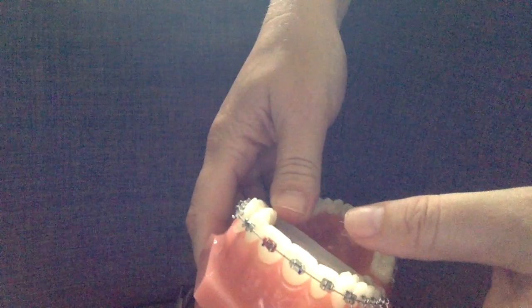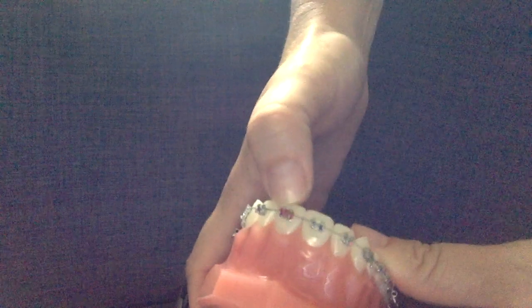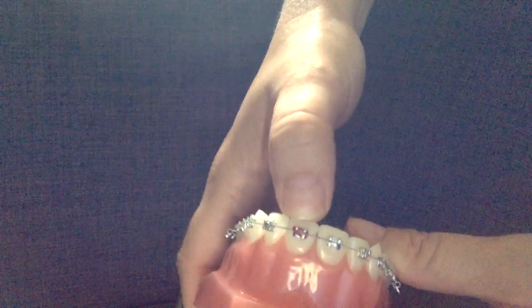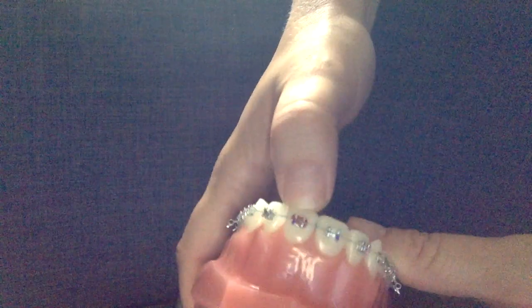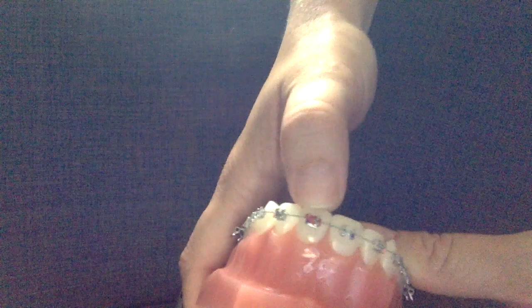A question came in from Brianna on our support site on Facebook about a ligature that's not fully on the tooth. The question was: is it okay if a ligature is only on three tie wings? And you can see here that the tooth shown has the ligature around only three tie wings.